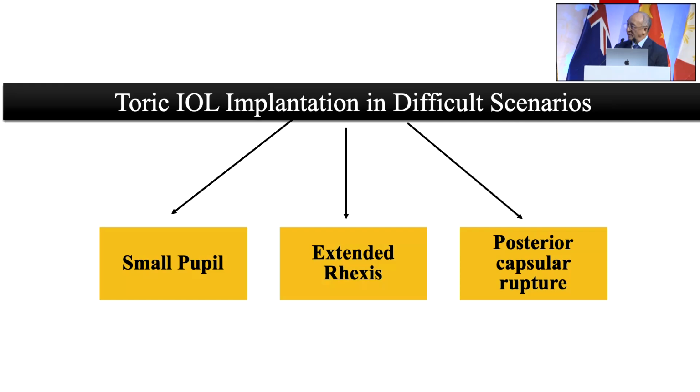Any specific way to calculate the IOL power in these cases? It's simply based upon what is the residual power. For every diopter of positive spherical power, that is, plus 1 means it's 1.5 diopters. If it's minus power, 1 diopter is 1 diopter of power. That is, minus 1 is minus 1. So if I have plus 2 diopters of spherical power to be corrected, it's a plus 3 piggyback that goes in. I think that's a very important point.